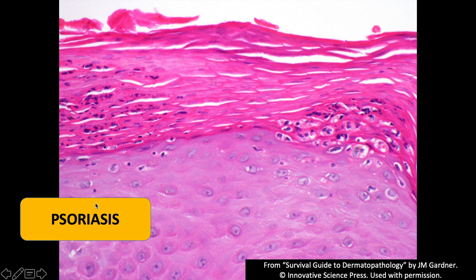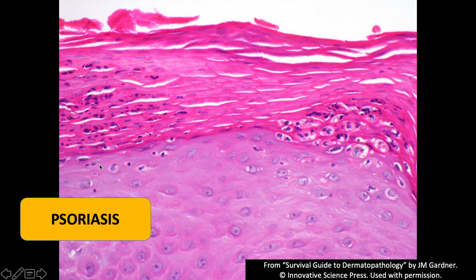Psoriasis also has neutrophils in the stratum corneum — a very characteristic finding that is usually present. These are sometimes called Munro's micro abscesses. There has to be a fancy eponym for everything in derm and dermatopathology, usually several of them for each disease. And again, the granular layer is gone — it's just wiped out.